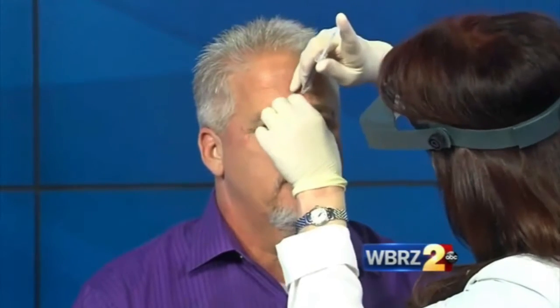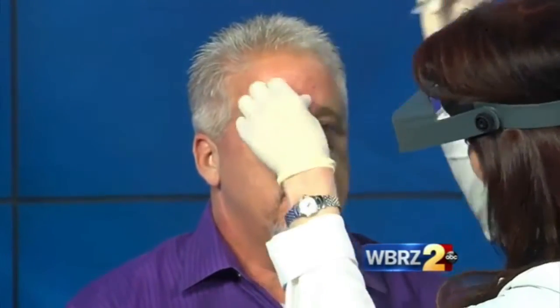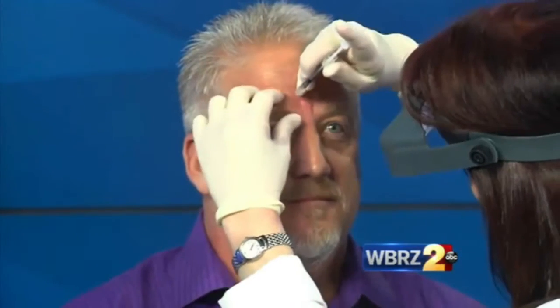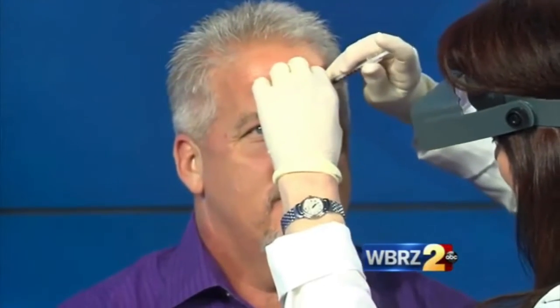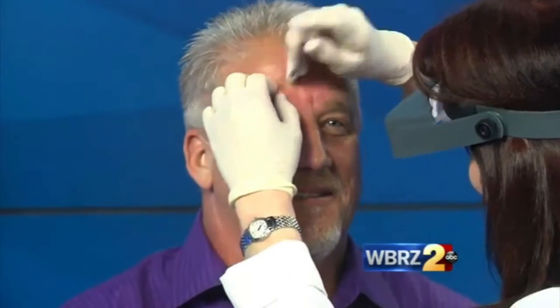And we're going to do it right here in the middle — pinch, pinch, pinch. You okay? Perfect. Pinch, pinch, pinch. Wonderful. And again — pinch, pinch, pinch. I don't hear any cries. No yelling. He's going to survive. And a smile — I like that.